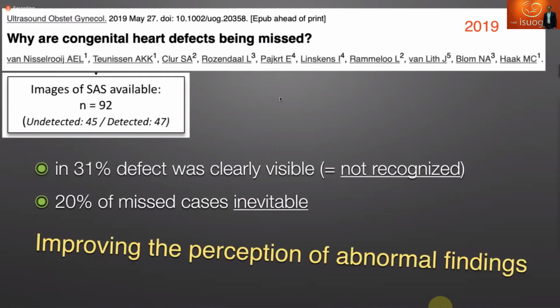And this is where we now come to our limit as human beings, where one of these days, artificial intelligence may be improving, or let's say replacing, some of our work. It will not replace the sonographer, but I can imagine the future when you are scanning that there is a background artificial intelligence telling you this could be abnormal, be careful, and then you wake up. It's like when you drive a car today, and the modern systems tell you that you are tired, or they know that there are cars around you, like in the Tesla car. So this is some part.